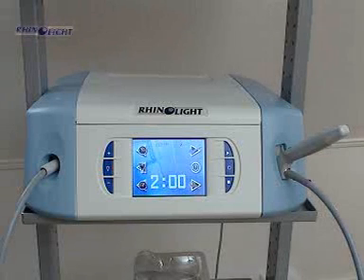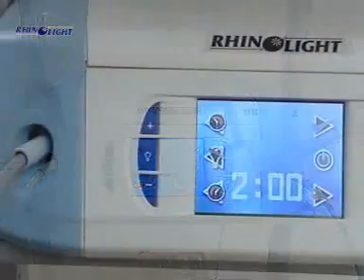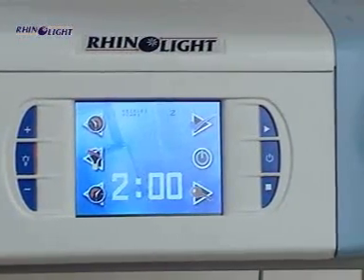Rhinolight Phototherapeutical Equipment is the only medical phototherapeutical product for the treatment of hay fever. Rhinolight is produced only in a desktop format; on request, however, portability is feasible.